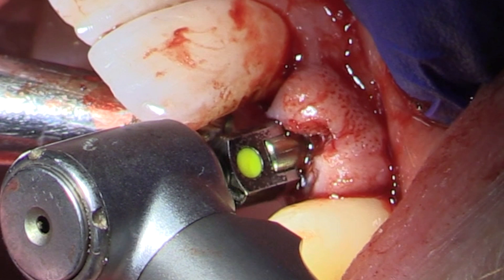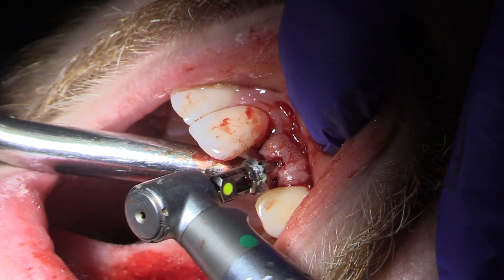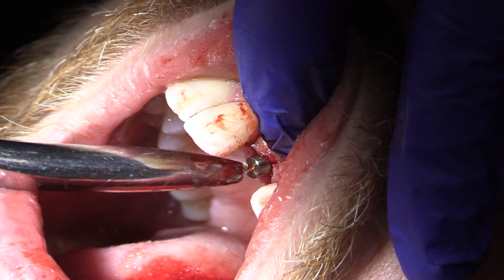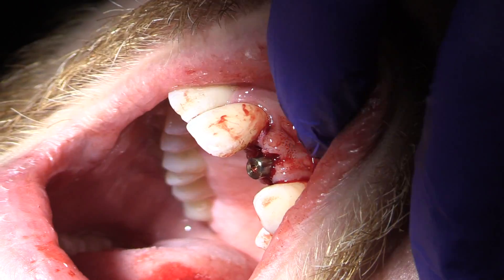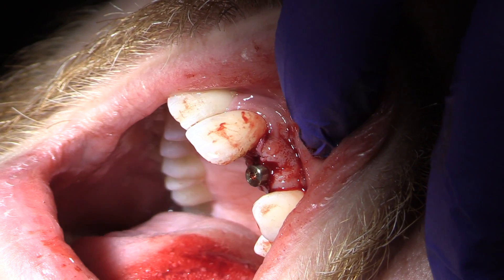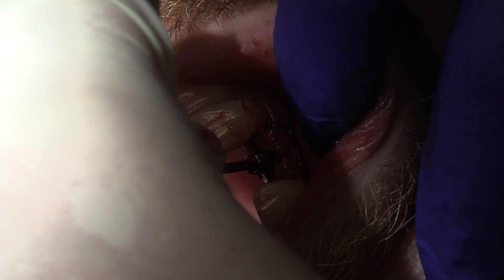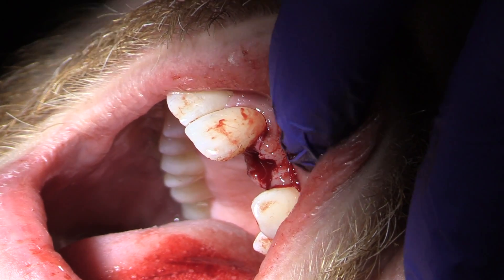We want to minimize inflammation here. Once this is seated down on top of the abutment, the bone mill is going to stop — it's going to make the perfect amount of bone reduction at the time of surgery or at second stage, like I'm doing here. There's nothing wrong with doing it at second stage because we can now make our temporary and start to develop the soft tissues. This actually gives a little bit of blood supply, and it's actually protecting the bone during healing because this site is a bone graft site, so it allows that to get a little bit of extra time.